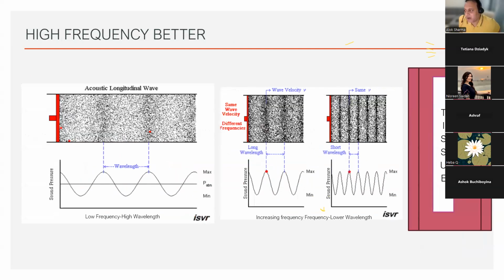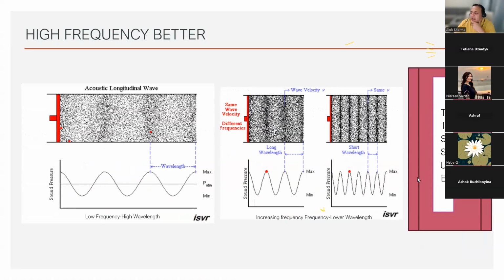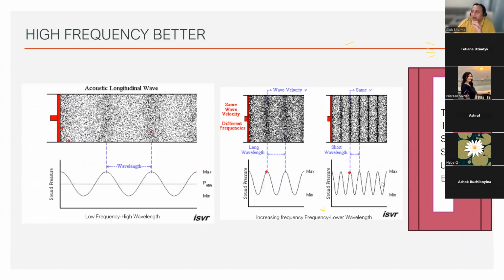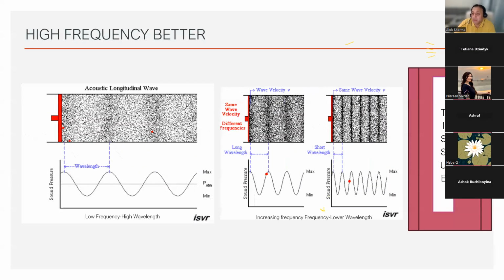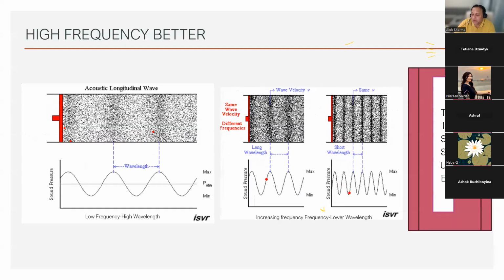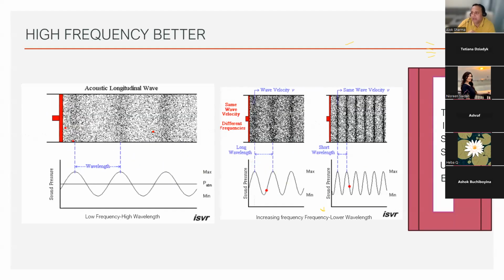Because when these sound waves interact with tissue, like I said, the number of echoes that interact with tissue will be higher with a higher frequency, which will produce much better tissue delineation, a much better image. A lower frequency from our perspective may not produce as good an image. And a lot of this will also depend upon how sound waves normally interact.